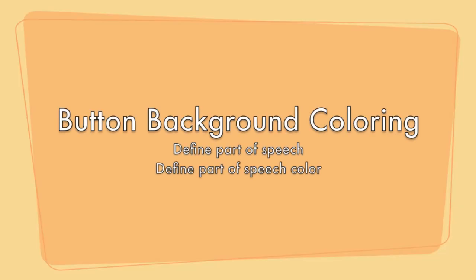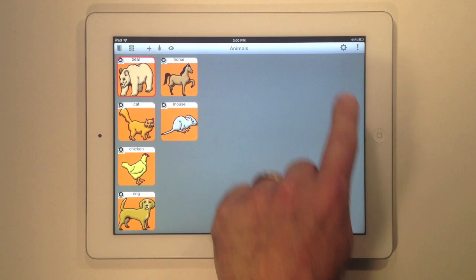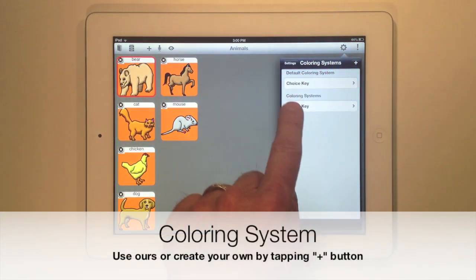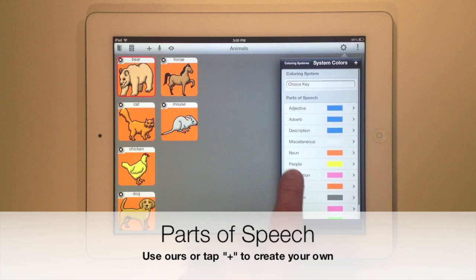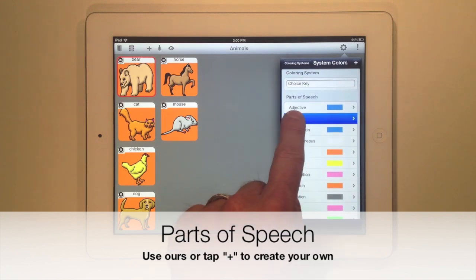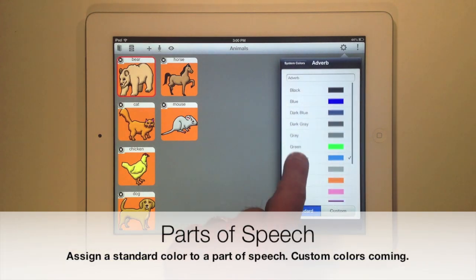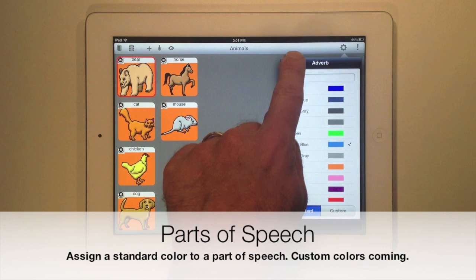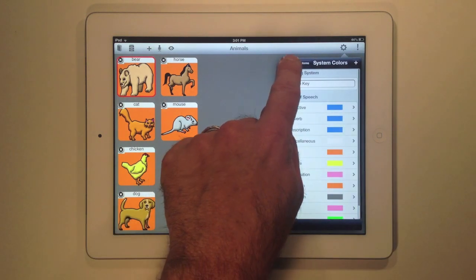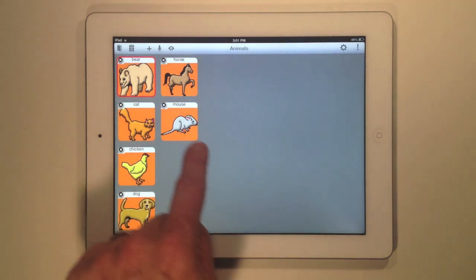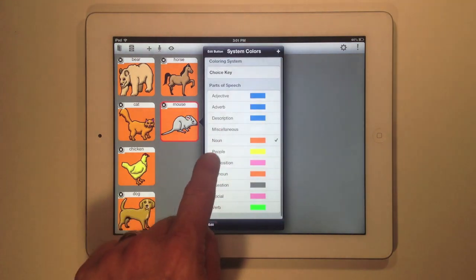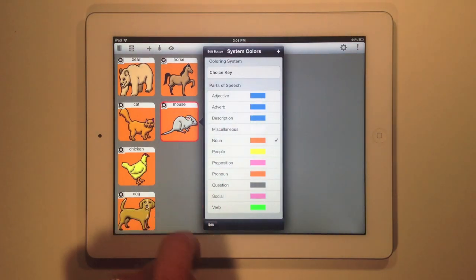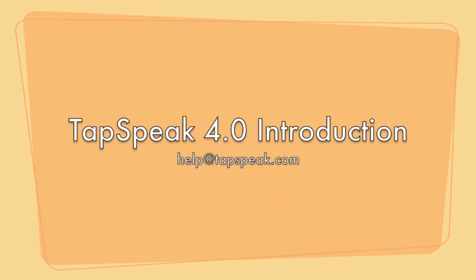We've added a completely customizable button background coloring system. You can use our coloring system or create your own. Colors are associated with parts of speech, which you can define yourself or use our defaults. To change a button's background color, simply long tap a button, go to the background editor, and select a part of speech. Take care.